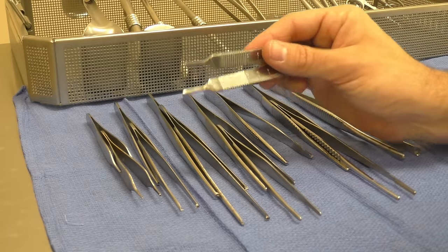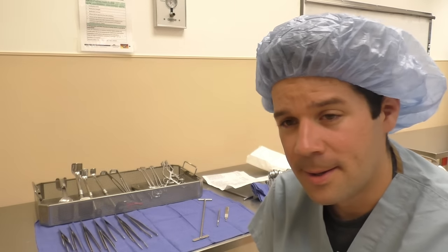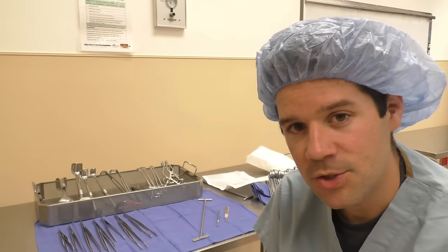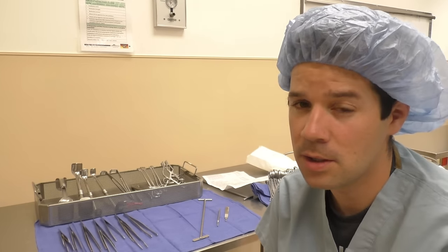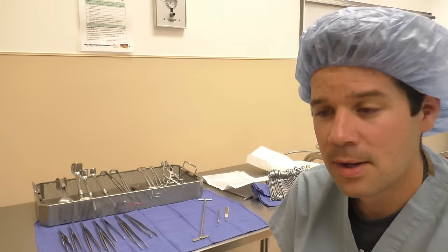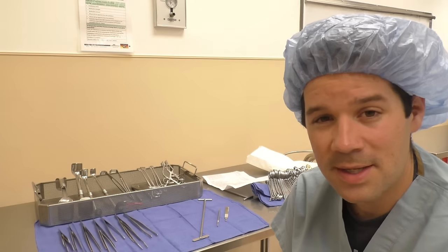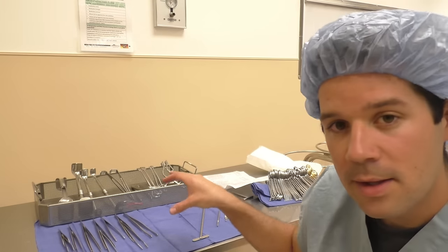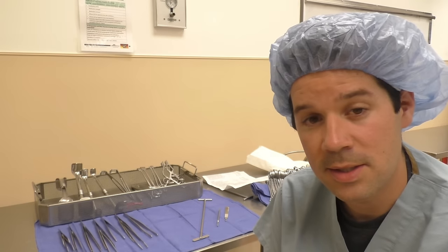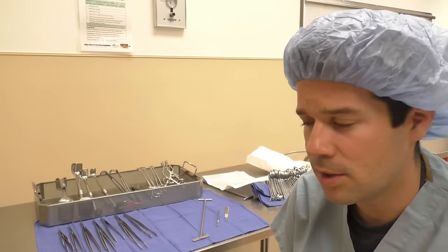And that's about it. That was our general minor tray. Very, very basic tray. A lot of very, very basic instruments that you should know as a tech student. And if you don't, definitely go over those instruments in that tray, because that's a lot of general use instruments in that tray that you'll be utilizing all the time in the OR.